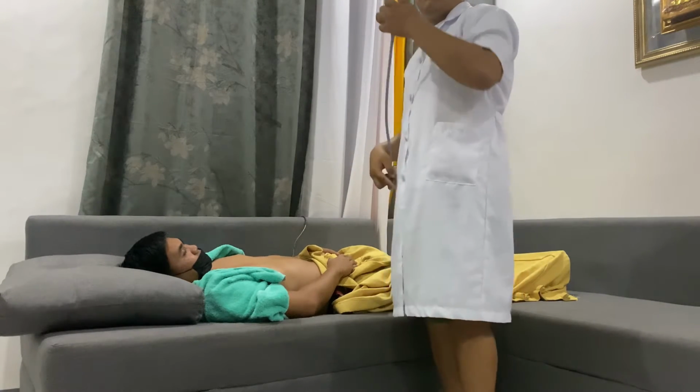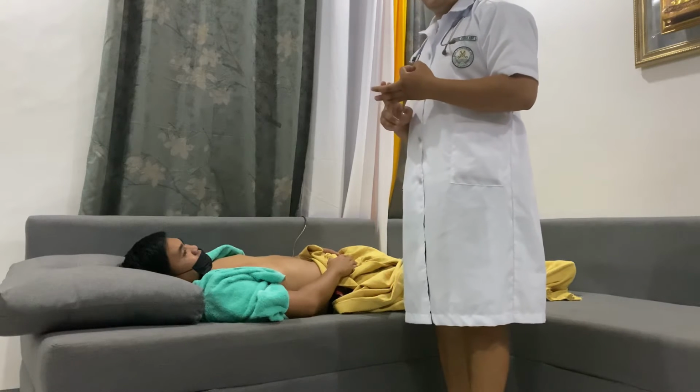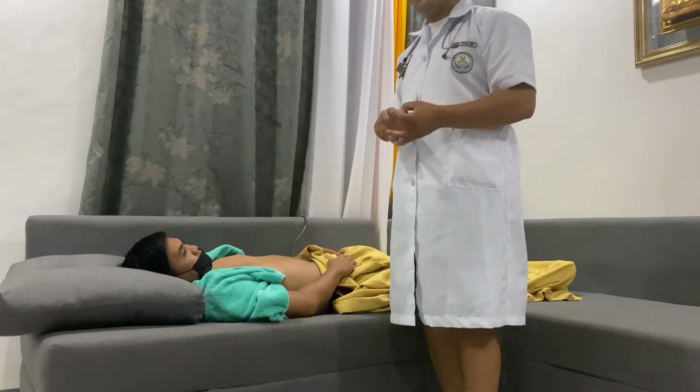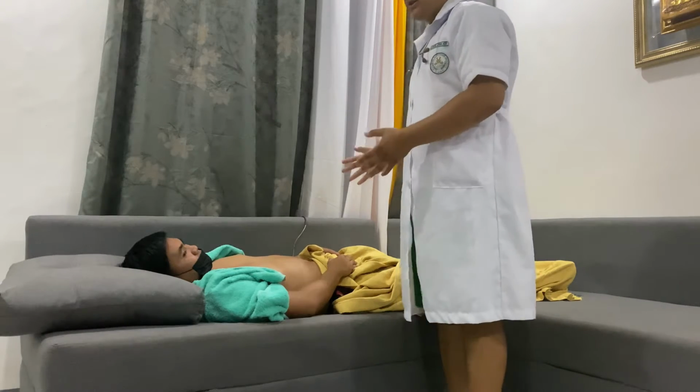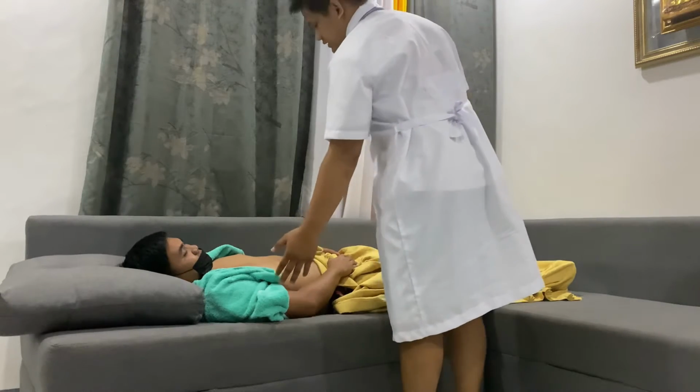While auscultating the aortic, pulmonic, tricuspid, and the apical, I can hear the S1 and S2 sound in supine position. Now, can you sit, sir?